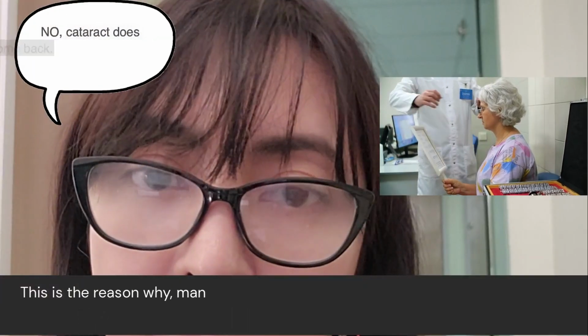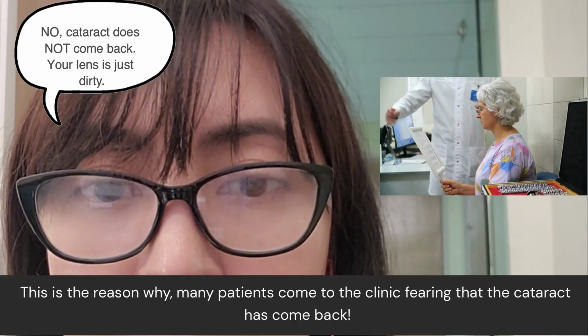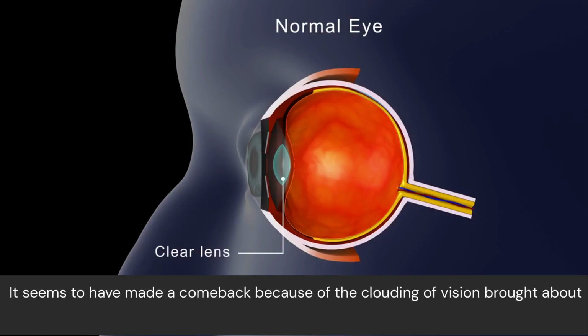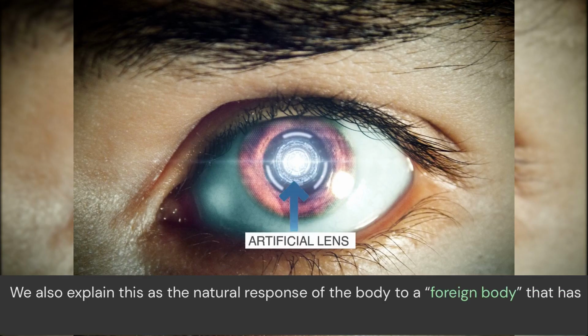And this is the reason why many patients come back to the clinic fearing that the cataract has come back. To them, it seems to have done so because of the clouding of vision brought about by the scar tissue. The scar tissue can be explained as a natural response of the body to a "foreign body," which is your artificial lens that has been left inside the eye.